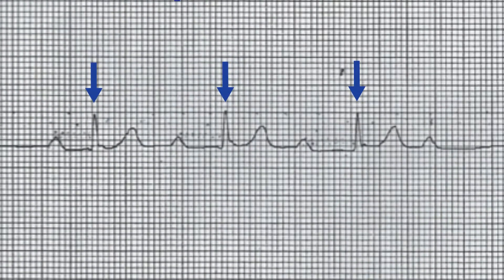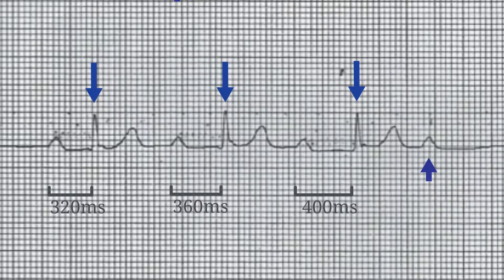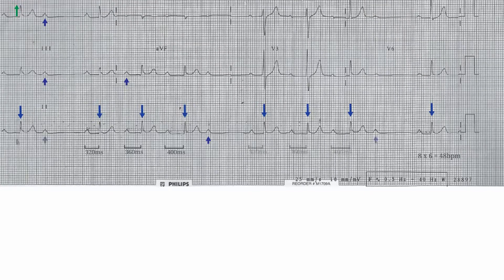The PR intervals are what diagnose the rhythm: the Wenckebach phenomenon. There is progressive prolongation of the PR interval until there is a non-conducted P wave marked here. The PR intervals increase in duration from 320 milliseconds through 360 milliseconds to 400 milliseconds before there is a non-conducted P wave. The process then repeats again with every fourth P wave non-conducted.